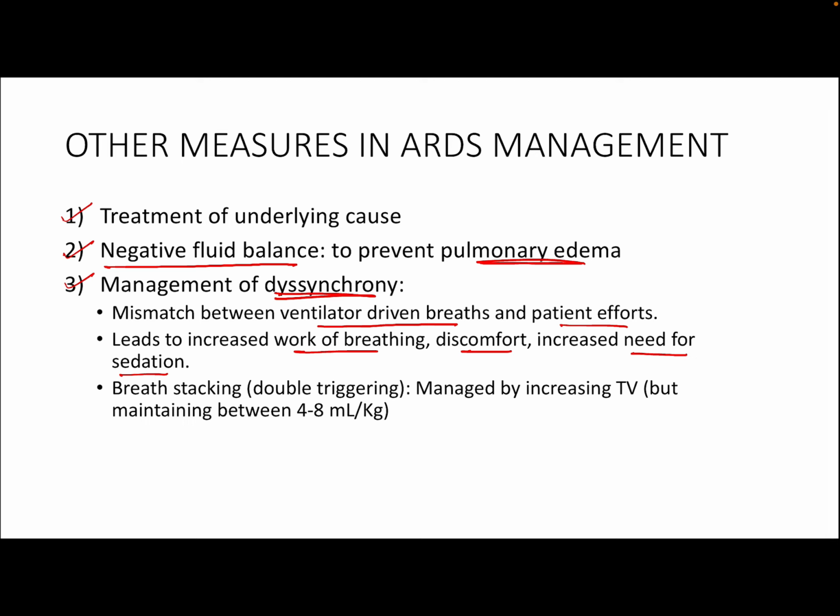It can also lead to something called breath stacking or double triggering. Now, what is this? Breath stacking can happen if the second breath is taken very soon after the first breath, so that there is no time to completely exhale that first breath. So this leads to air stacking up in the alveoli.